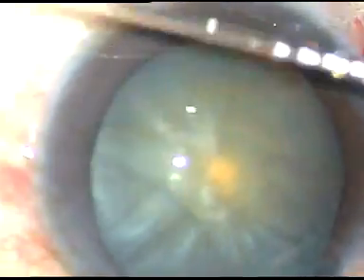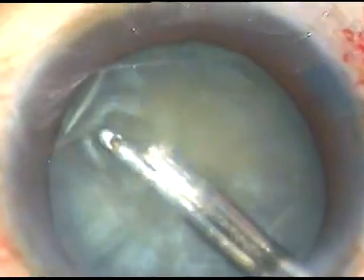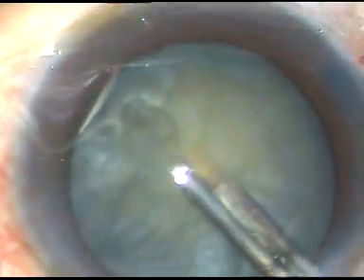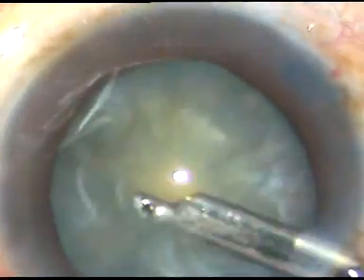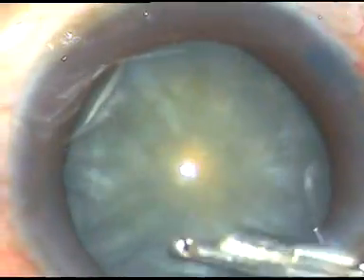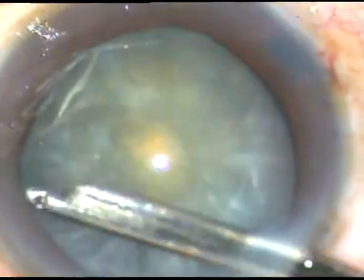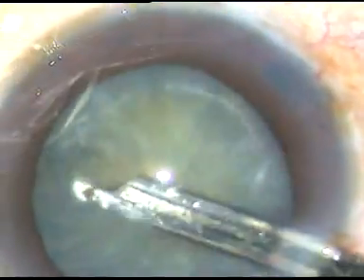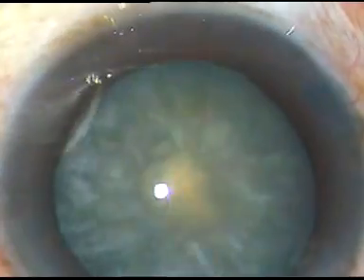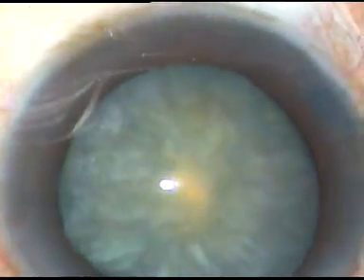Now I aspirate some cortical lens matter through this small opening and squeeze out some cortical matter through this opening to reduce the intralenticular pressure. The intralenticular pressure drastically reduces by this maneuver, and the cataract behaves very normally. When we try to enlarge the rexis, it doesn't tend to run away.